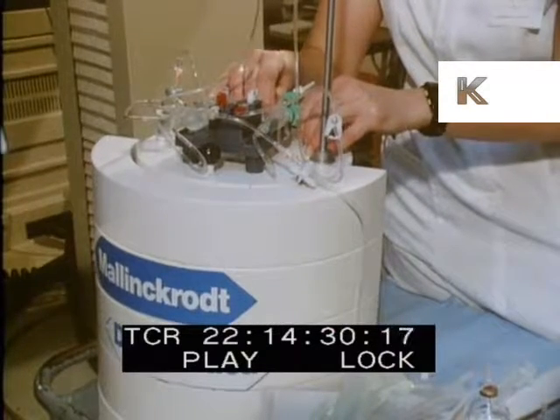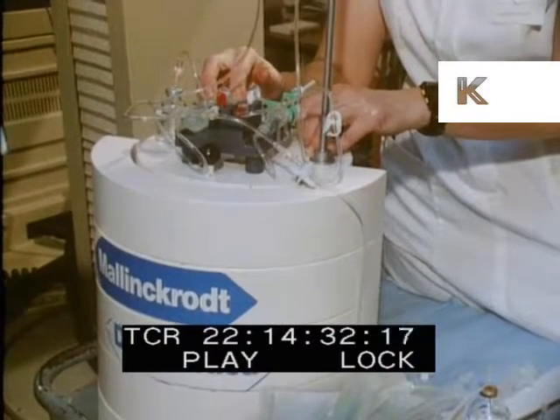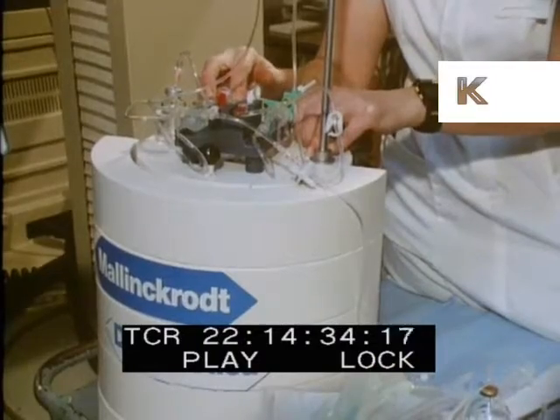This is an exciting technique for monitoring heart function, and an important tool for the early diagnosis of cardiac disease.